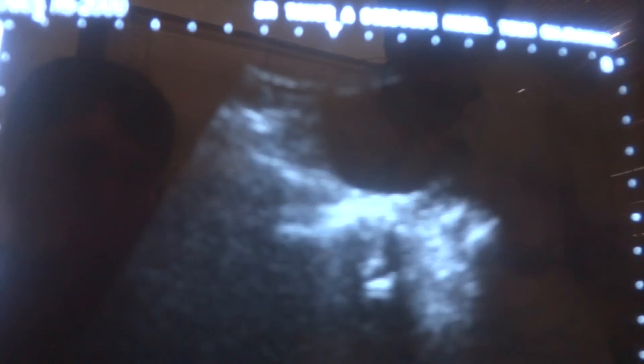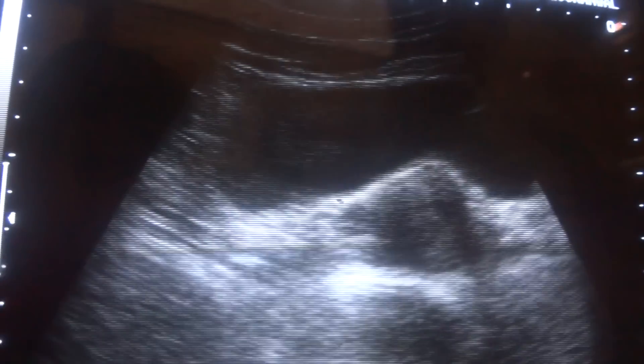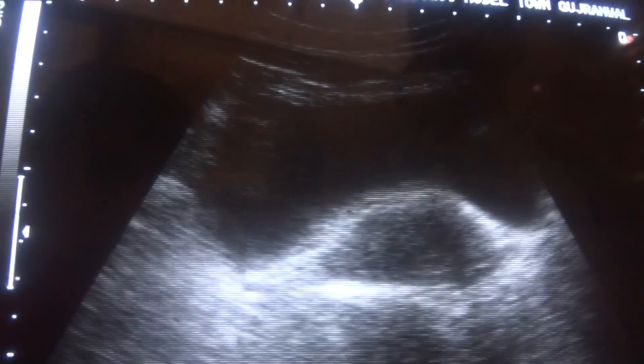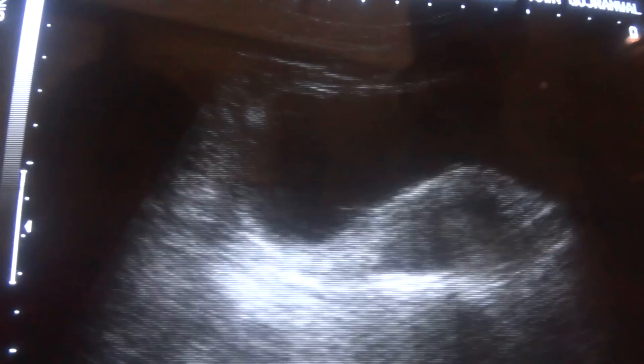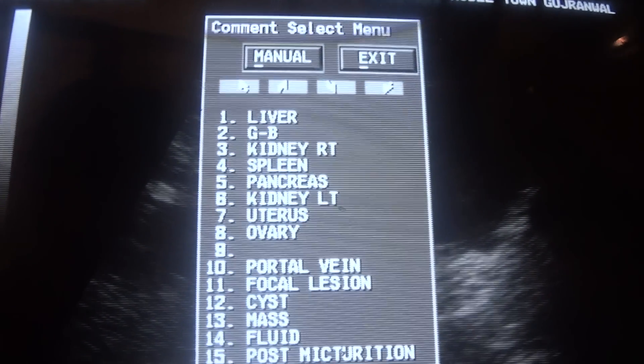This is the pelvic study of a 36-year-old female patient, and her left ovary has been removed. You see this is the urinary bladder in transverse section.